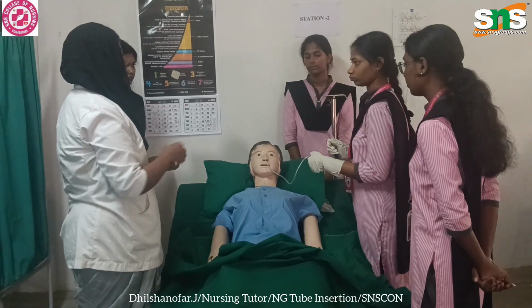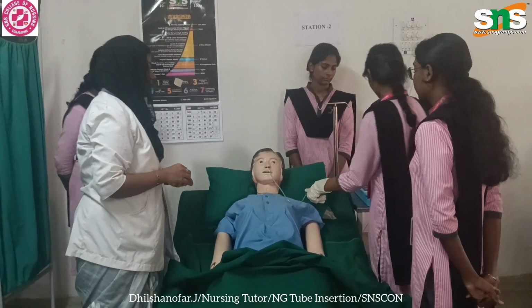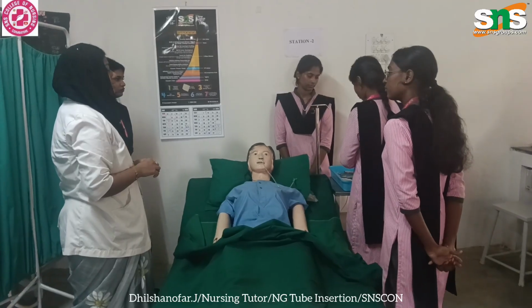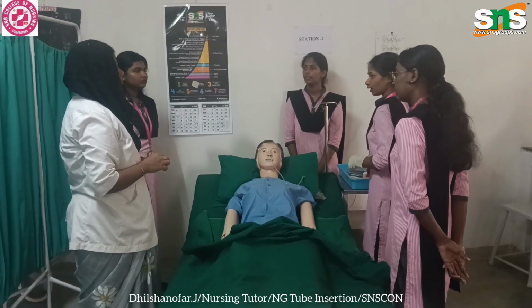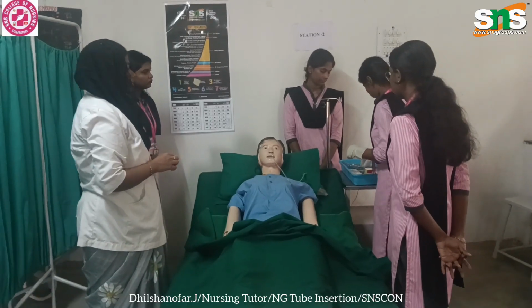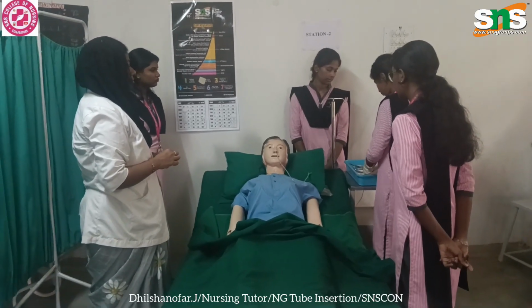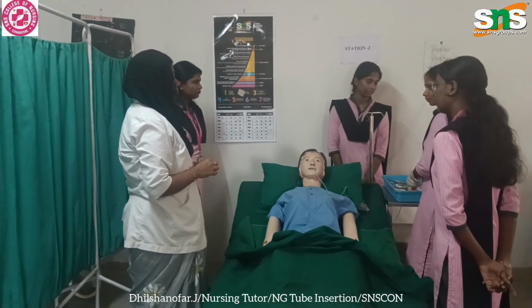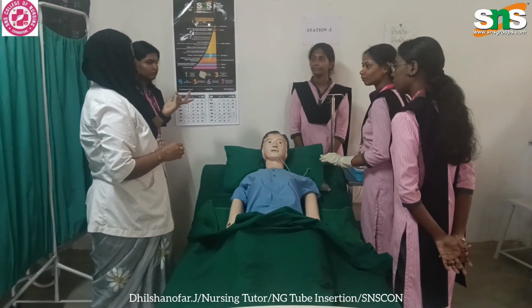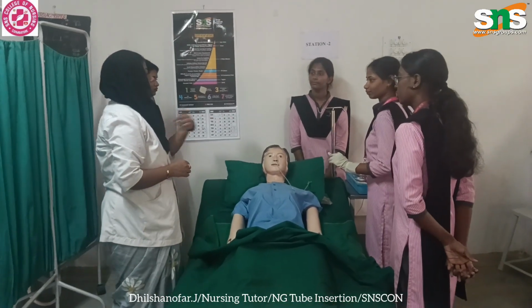Then you have to discard it in a kidney jar. And the next method is auscultation. How will you do it? Take 5 ml of air and use the stethoscope.